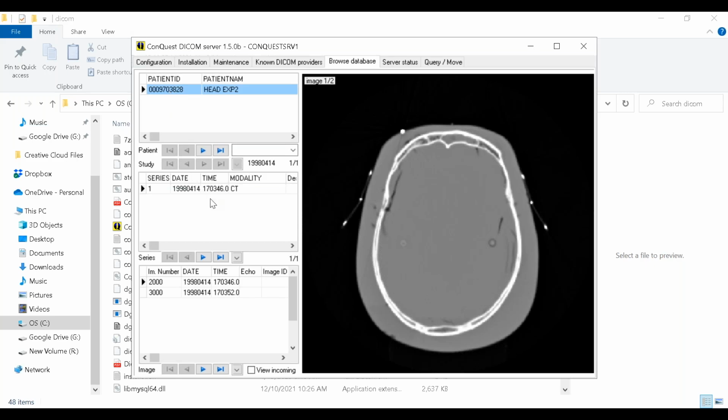So I can create different series. Notice the series has a modality. The modality is the type of device that's taking the image. Notice the type of device that's taking the image is the CT, right? So I might have one that says DX for my X-ray, and then I might have one that says MR for my MRI of the back. But they will all be different series under the same study.